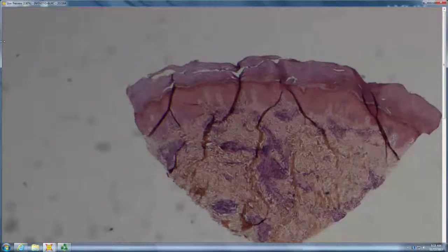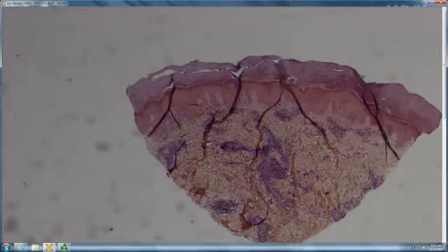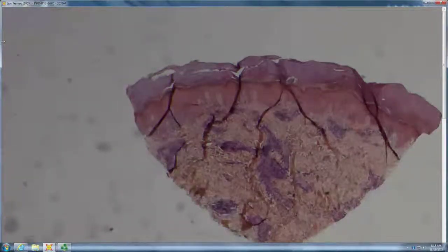Almost anything reparative on the shin, if you do a re-excision of a squamous cell biopsy, is going to have some of this tufted angioplasia on the leg too. It's just the way the leg heals, it heals with tufted angioplasia. So it tells you you've got something reactive on the shin, which is often stasis. Okay, let's see what we've got.